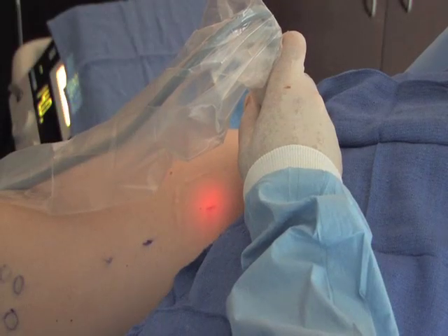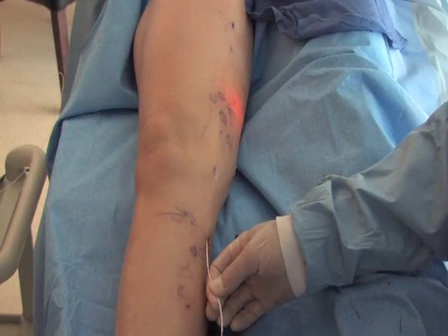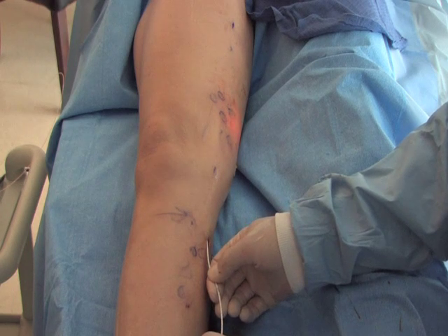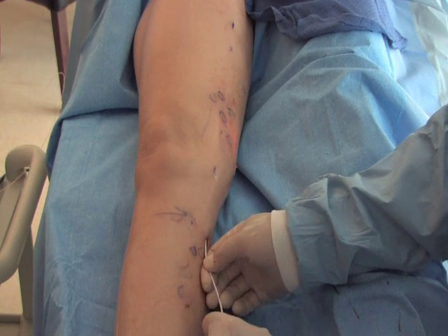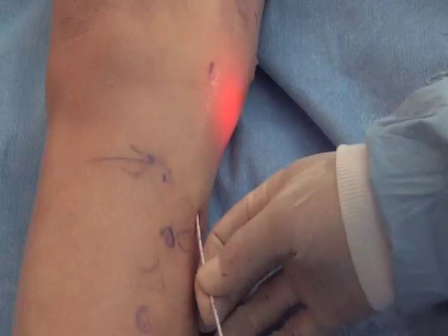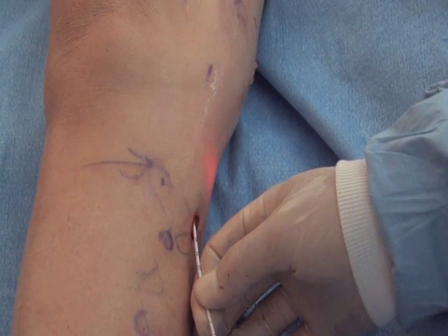Use ultrasound to verify that the tip of the laser fiber is inferior to the sapheno-femoral junction. Activate the laser while continuously withdrawing the laser fiber at a rate of 1 cm every 5 seconds, applying more energy to the cephalad portion of the vein. The goal is to deliver between 60 and 80 joules of energy per centimeter. For the average 30 cm greater saphenous vein, the total energy delivered would be 2,100 joules.